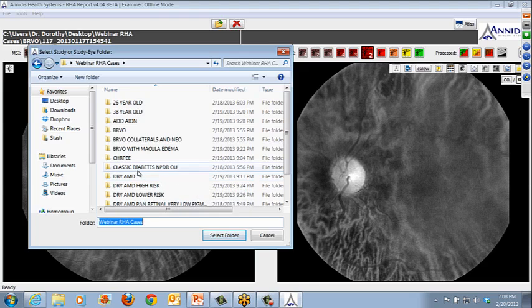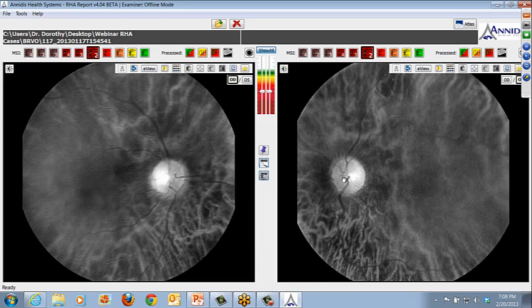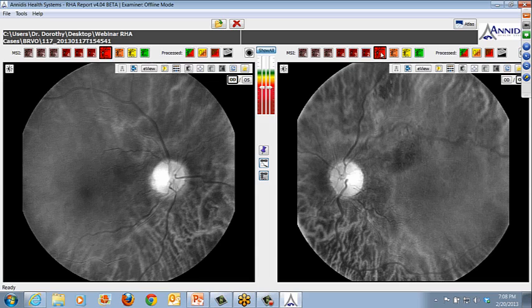Yes, please, John. Sure. On this case that you're looking at right now on that left side, how would you recommend that a doctor make that distinction whether or not that is elevated or not? I would actually compare my imaging to my ophthalmic view, because you're going to look at these patients with the 78, or a 60 wide field lens, and look at their retina to look for other clues of elevation.